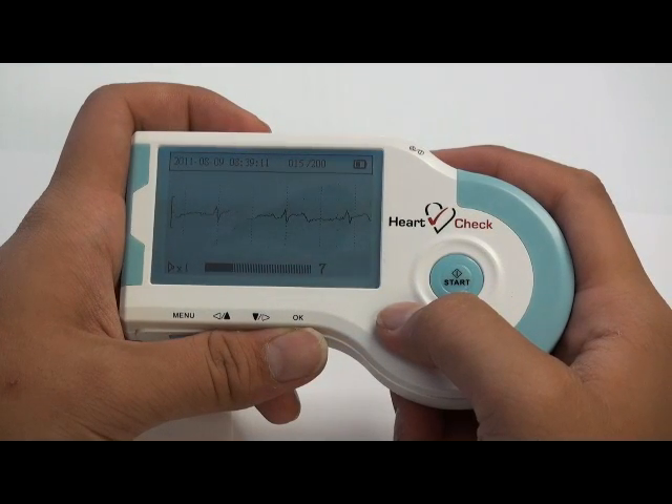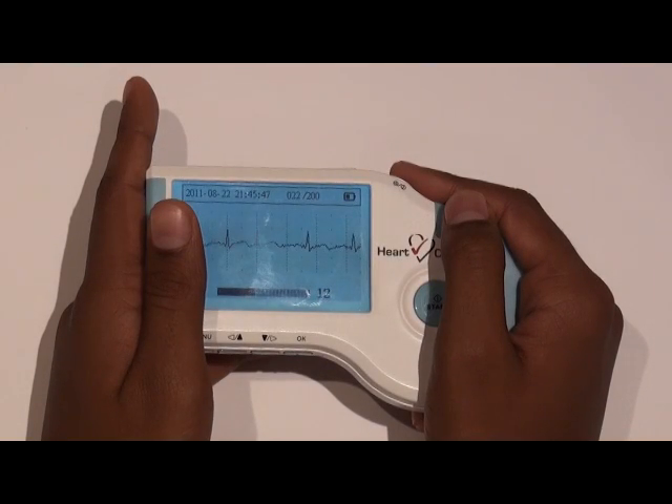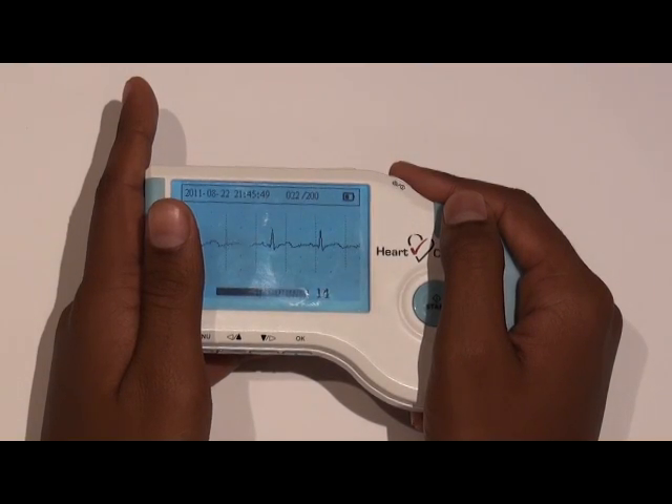The patient must cover the two metal plates on each side of the device and press the start button to begin the heart health evaluation, displaying the heart rate and ECG waveform.